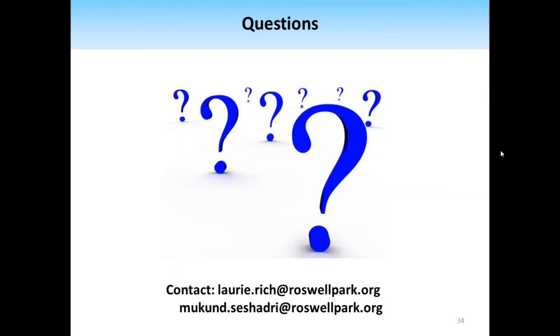Great. Another question: using photoacoustic imaging, what was the time scale of detection of radiation treatment failure? This would speak to the ability to quickly determine when a treatment is not working. Yeah, these are all great questions. Based on our findings, the change in oxygen at 24 hours was an indicator of response at 2 weeks after treatment. Of course, that's 2 weeks after treatment. Following up long term would be really interesting.